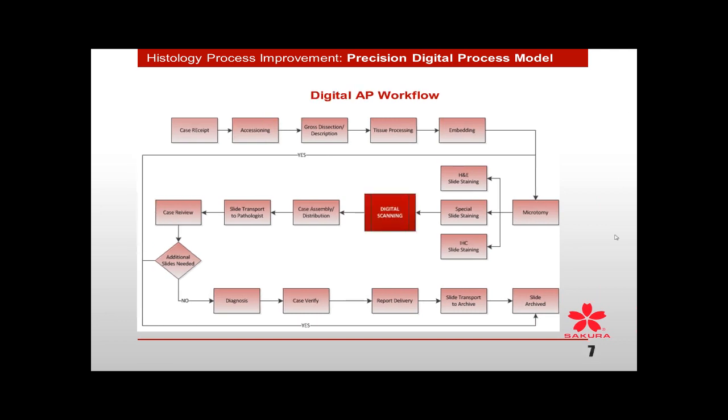This is the simplified digital workflow. I see this a lot of times. The vendors will come in and say, well, we just have to plop in a digital scanner. That little red box can turn your department into chaos. Again, now you have a new technology that not everybody is going to be comfortable with, that many will not be familiar with, but can sometimes demand a lot more of our time and effort as the technician and technologist than we ever thought would happen to us in the department.